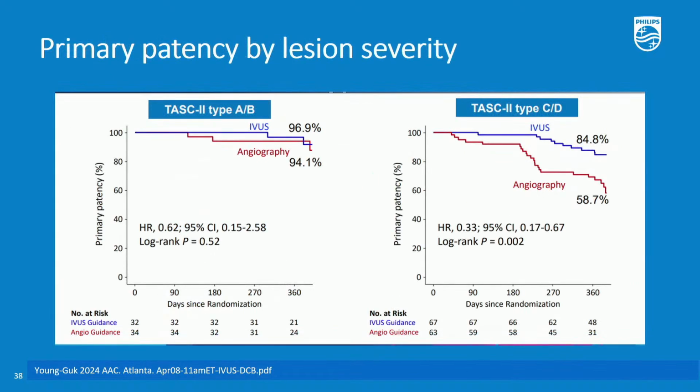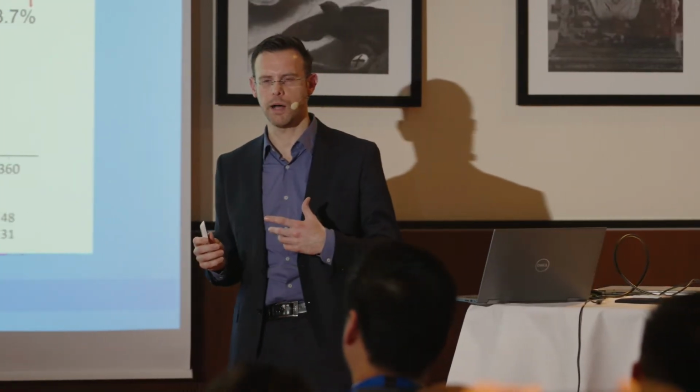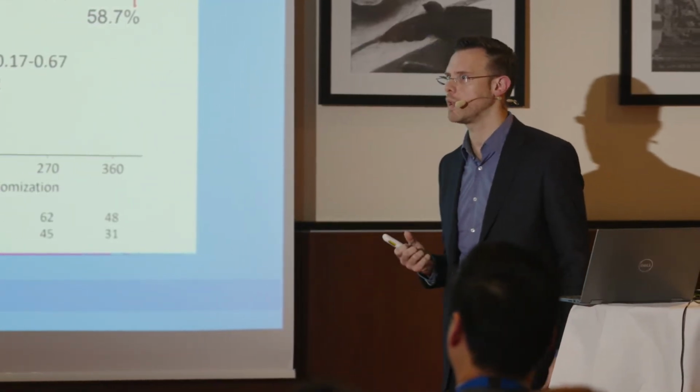Now, this is again a very important take-home message because it starts to, I'm starting to wrap this up now, guys, you'll be pleased to hear, beg the question: when should we use IVUS? NT said he uses it in about 50% of cases. I think it's probably fair to say we're about the same at the Royal Free as well. But the question is not how often, it's when, isn't it? When should I use it? When are the cases that will benefit from it the most?